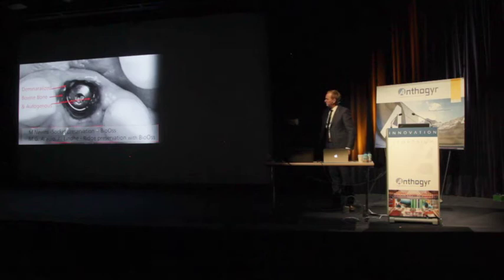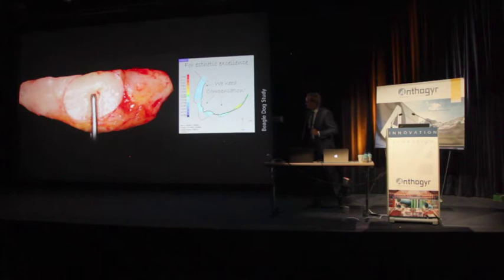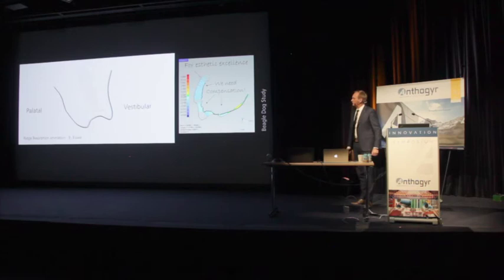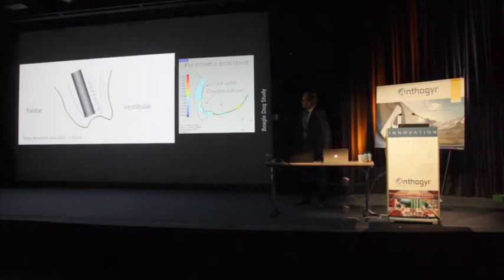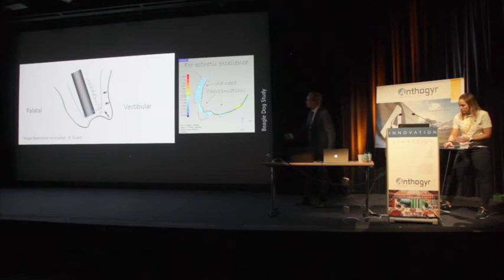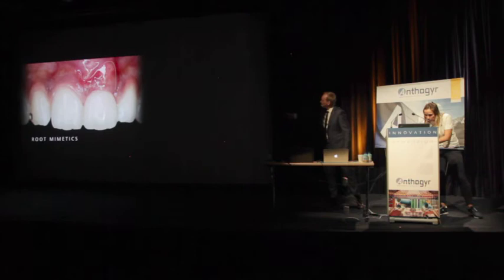and then to compensate the missing volume, I use a mixed graft. Epithelium in the middle, de-epithelialized on the wings. So the implant is placed not in the center but more palatal. I graft the buccal area and then I know I will get shrinkage, so I don't want my soft tissue to collapse. Therefore, I will make it thicker by placing this graft in the area like this. So the two wings go in a palatal and a buccal pouch. And in the center, I have the epithelium. And this gives me the illusion of a root.